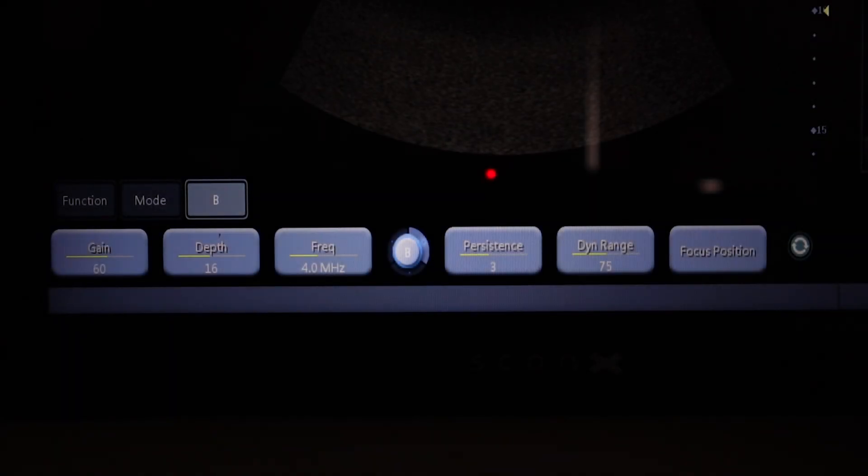But what we will do is show you how to turn it on and off on the system. So to change into harmonic imaging, first of all make sure you are in your standard B mode application. The B will be highlighted here. This is just your standard application for 2D imaging.